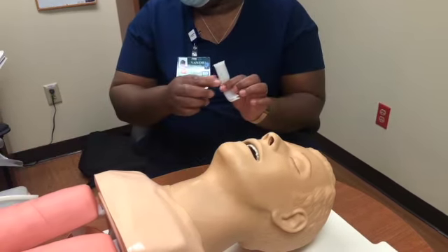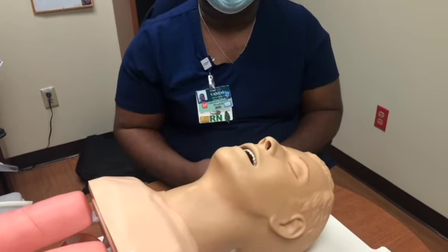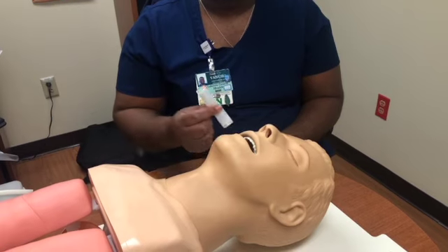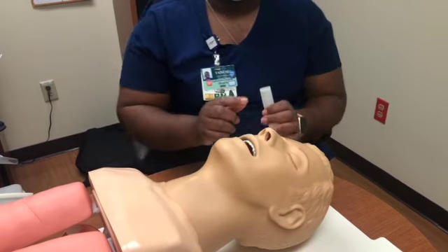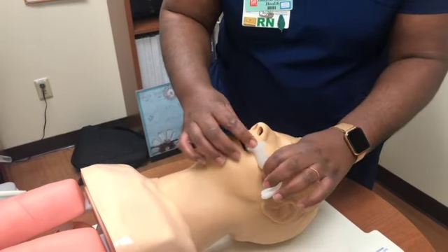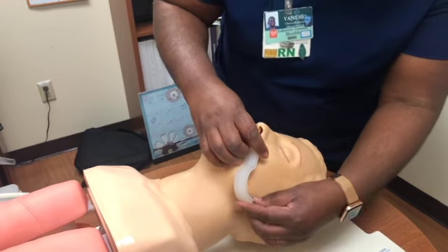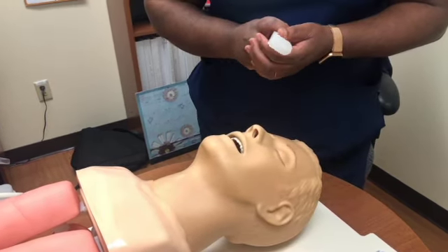In the oral pharyngeal airway, you only want to use this on unconscious patients. You do have to measure to make sure you have the appropriate size. To measure, you would measure from the corner of the mouth to the end of the mandible. And that way you know you have the appropriate size.